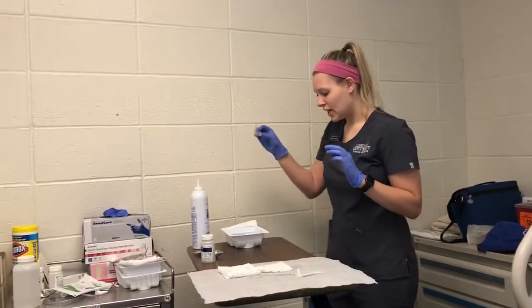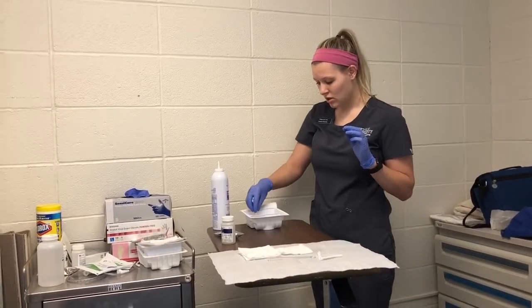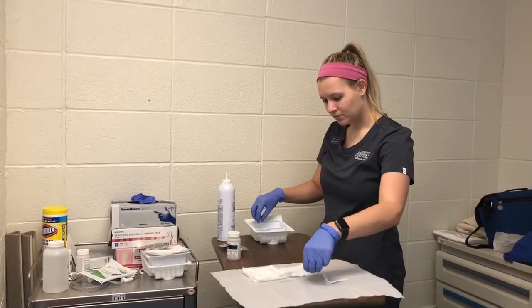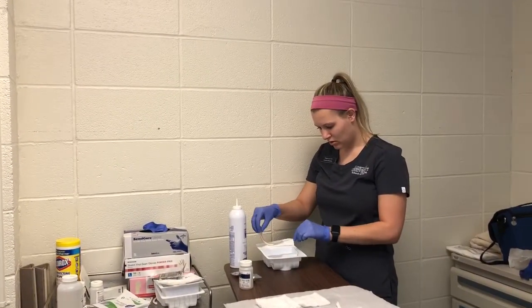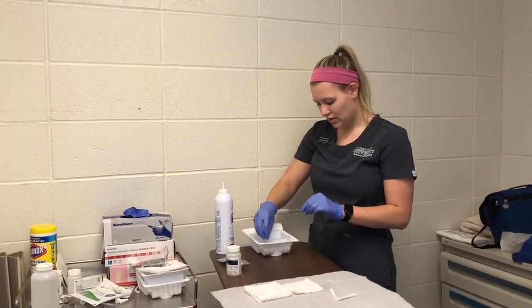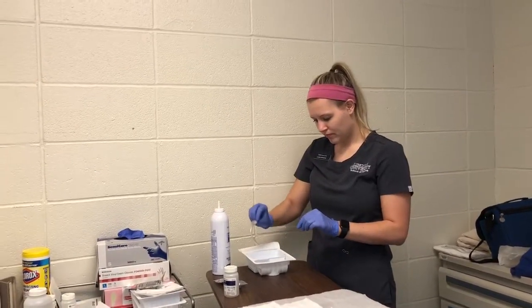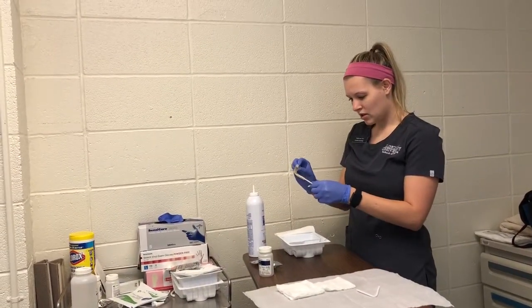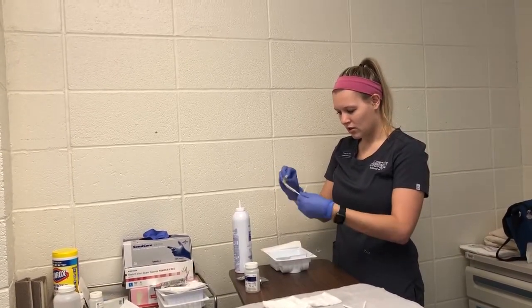And then what I'm going to do is I want to put it in the peroxide and sterile water solution first. And I'll just hang on to it with my non-sterile hand. This hand is sterile, so I can reach into my sterile field, get out my sterile brush, and clean the tube. And then I can go into this side. This is just the sterile water side. Kind of rinse it out. Then go over here and get like a pipe cleaner, whatever you get in your kit, and wash it out, get it a little bit dry so you don't put a wet one in there.